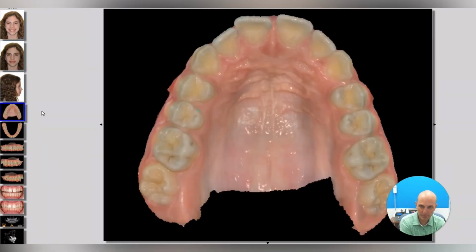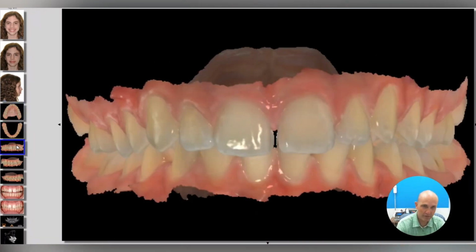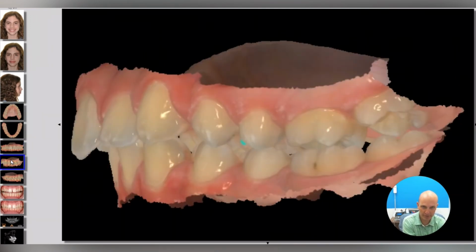And then for our intraoral pictures, we do a combination of photos and use our scan. So this is an Allied Star scan. I love our Allied Star. It's super quick. The tips are autoclavable and so very inexpensive. They come in two different sizes, an adult size and a pediatric size for those scan tips. So you've got our two occlusal pictures, and then we've got our center picture and then our two buccal pictures.